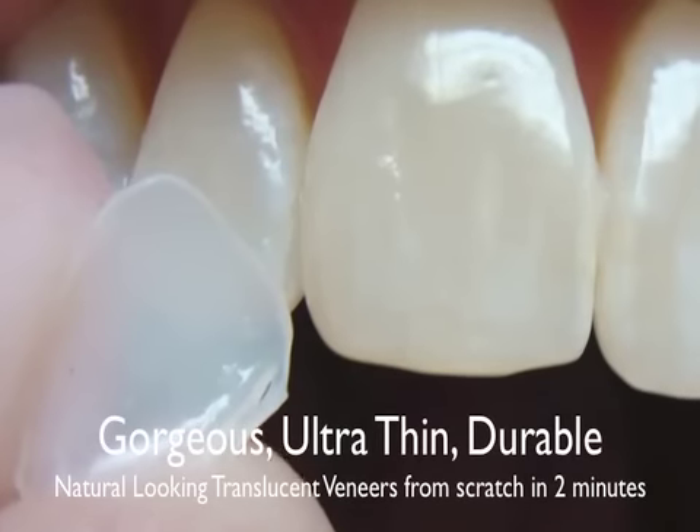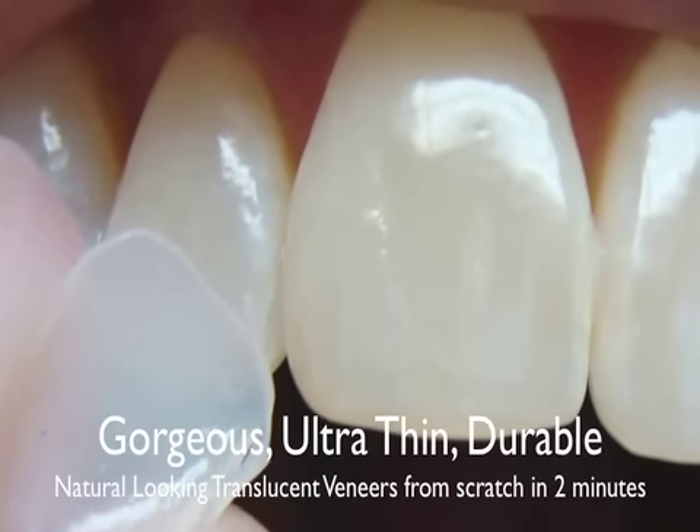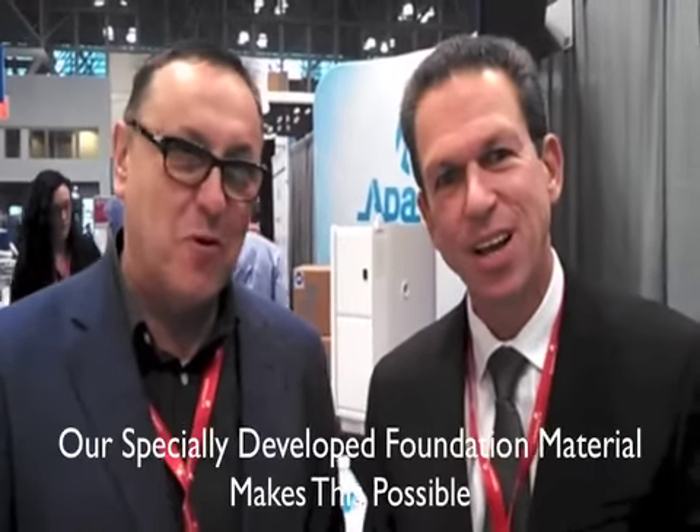I'm going to show you how you can make an EZ Smile light veneer in two minutes. It may sound impossible, but Igor, is it impossible? I think it's now possible. In 25 years in the dental business, it's really unbelievable.